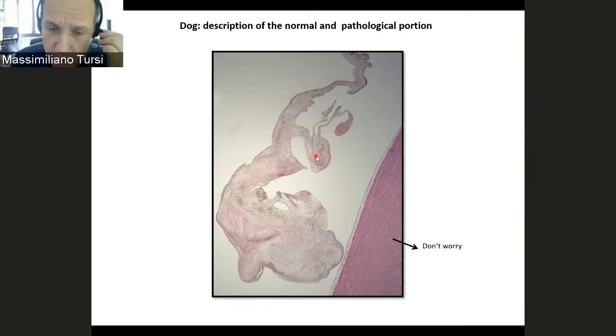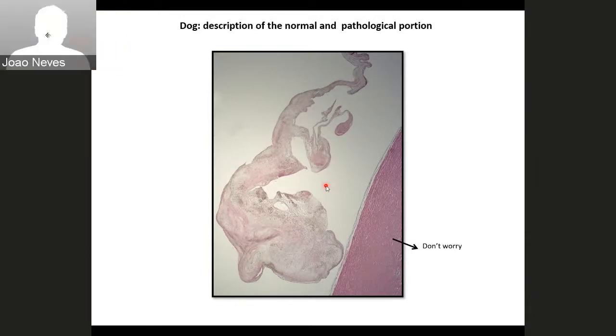What do you think about the chordae tendineae? Of course, there is thickening because of the degeneration. What can induce this kind of finding? It can induce the rupture. Yeah. Okay. Thank you.